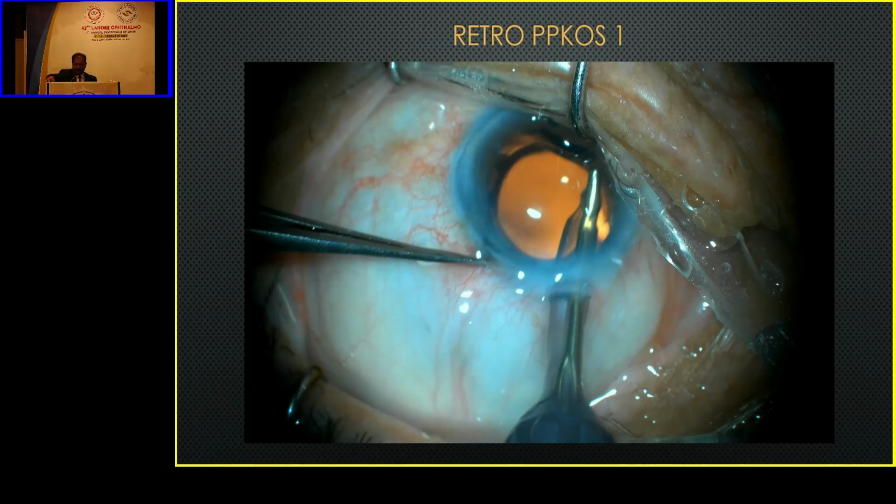So all in all, this is a very good tool. We are not using it on a regular basis. You must start it. Last time I saw a live surgery, a very senior surgeon was performing, and he was using Simco. So this is time to shift to it. You will enjoy it.